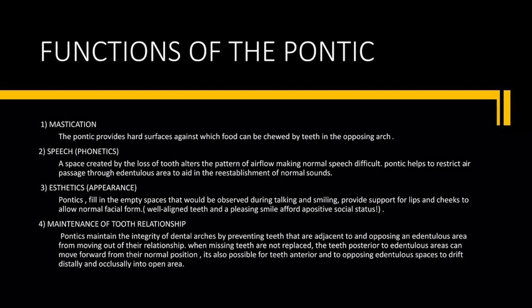What's that last one say? Oh, it maintains tooth relationships. So if there's a Pontic space in somebody's mouth, and it's empty and it's not filled, the teeth opposite it will shift and move and sometimes extrude, especially if it's a lower free end where the molars are missing. The upper tooth over time will tend to extrude down towards the lower ridge. And we've all seen that on the models we work with.